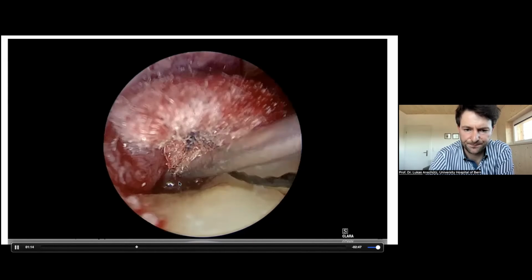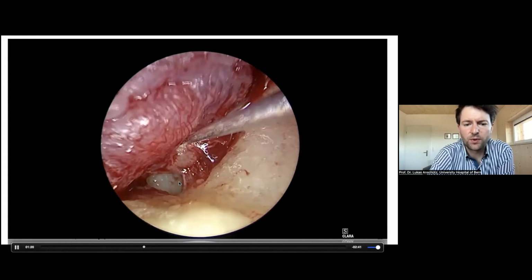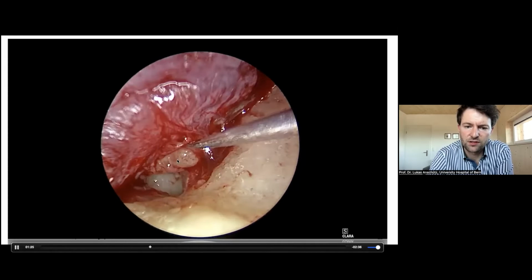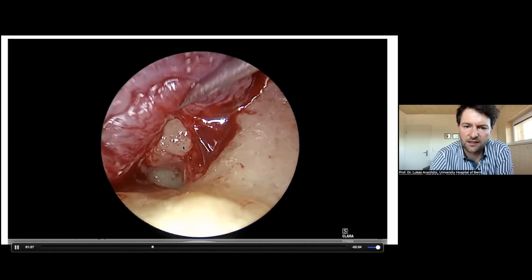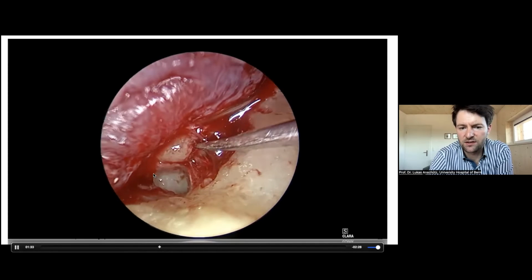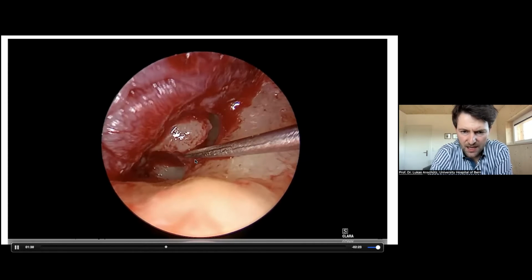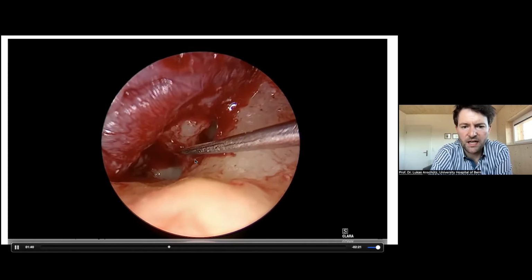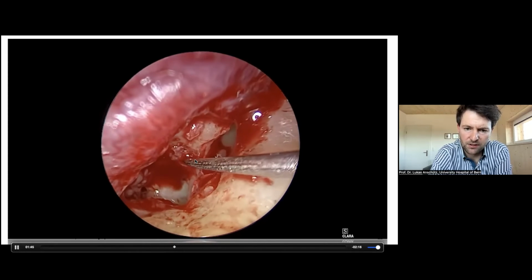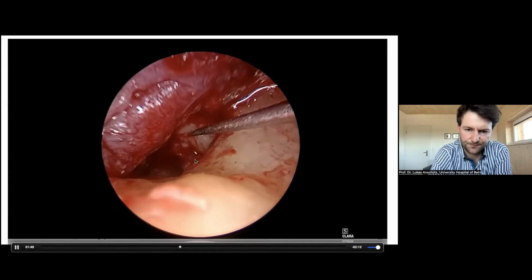Everything is inflamed. But you can see even this kind of case you can manage in a good way with the endoscope. You can see here this is the incus, the refined incus, which was put back again. And with the pick here, I can dissect the scar tissue away. Here we can already have a glimpse at the stapes. And so we can now mobilize these prostheses to be able to remove it. You can see now it fell down.